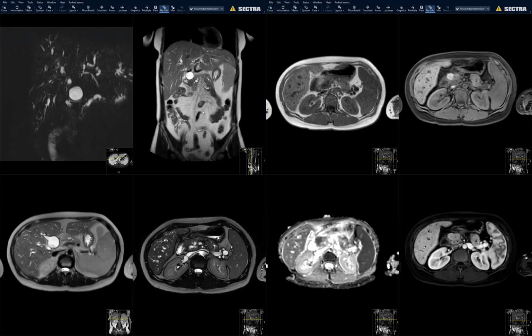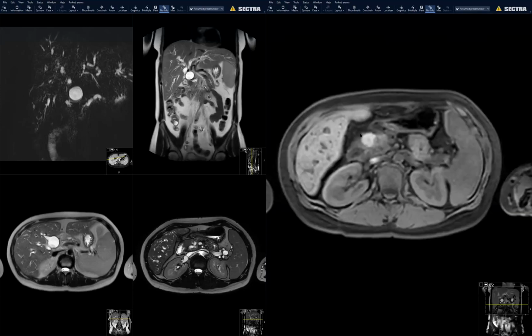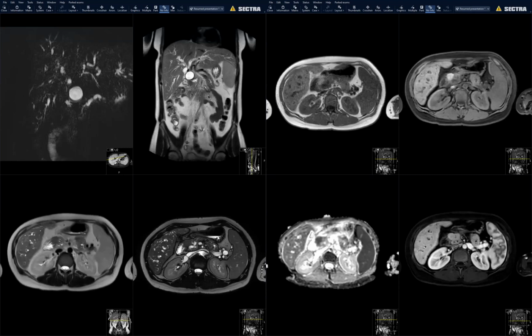Sorry, could it be a stone? Did we rule a stone out? You mean could this be a stone? Yeah. Do we have CT? Is it dense? Well, there was an outside CT, so we don't have that yet. I'll try to get a follow-up once I get the CT, but I really wasn't sure what to make of this, so I wanted to see if anybody's seen anything like this before. My first thought was also a hematoma, but I saw this yesterday and it looked like there was actually some low-level enhancement in it, even on the subtractions. So I just didn't feel like we could call it a hematoma. Okay.